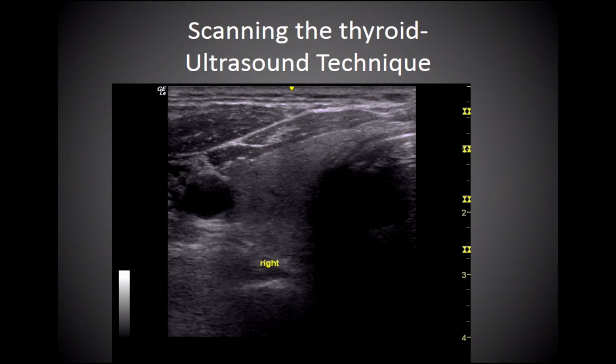Well, let's begin by looking at some ultrasound technique. The ultrasonographic examination of the neck is performed with the patient in a supine position. The patient's neck is hyperextended with a pad or towel centered under the shoulders to optimize exposure to the anterior neck. The examiner sits at the head of the bed and rests his or her elbow or forearm on the adjacent bed next to the patient's head to steady the transducer. High-frequency linear transducers provide optimal resolution and visualization and is easy in most patients.